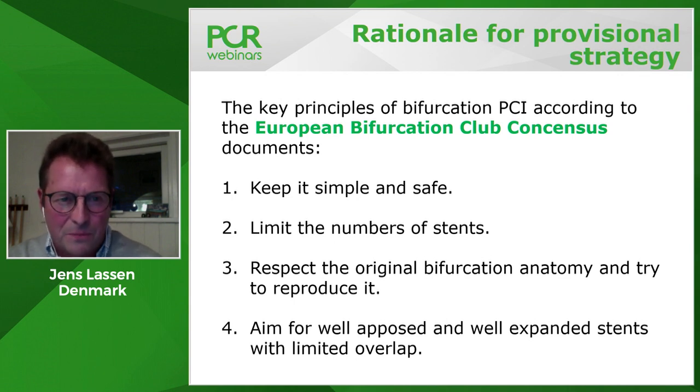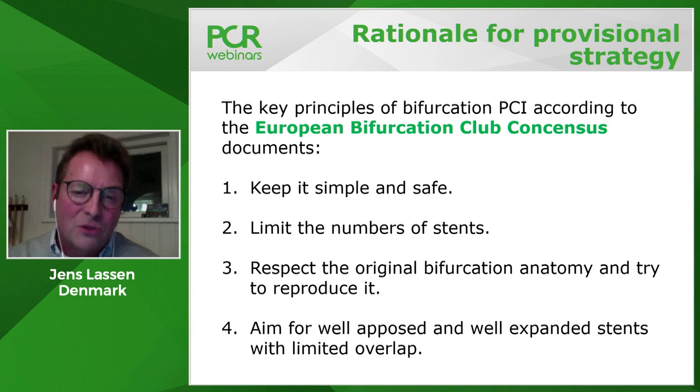The risk of this philosophy is actually to lose the side branch during the procedure, which means that if you go for this, you have to protect the side branch with a wire, and you need to have in your toolbox tools to save the side branch if it closes during the procedure. But we will also address that in a bit. So next slide, please.